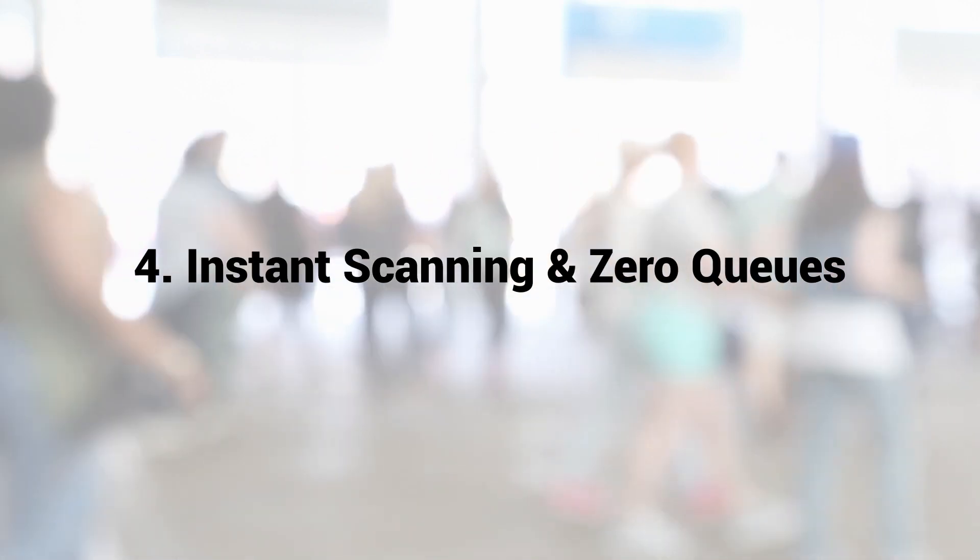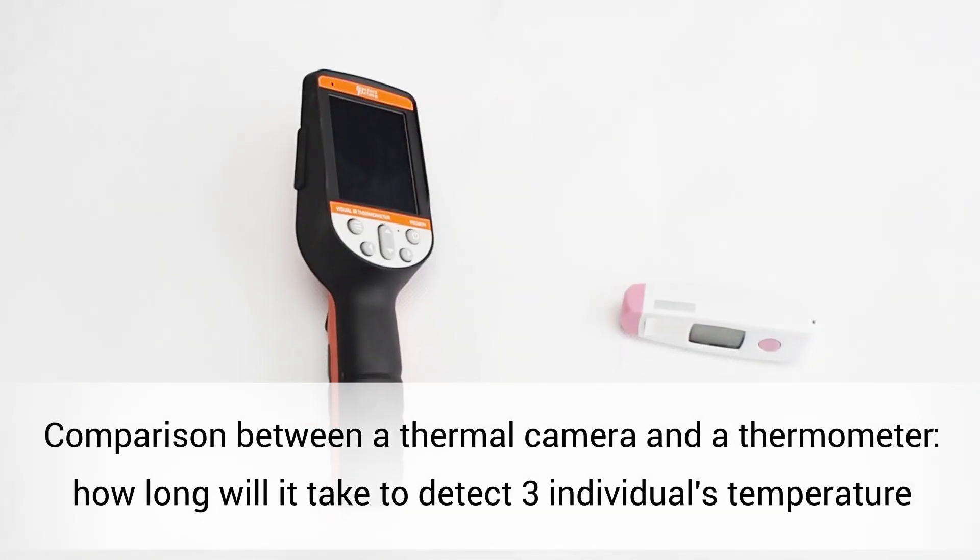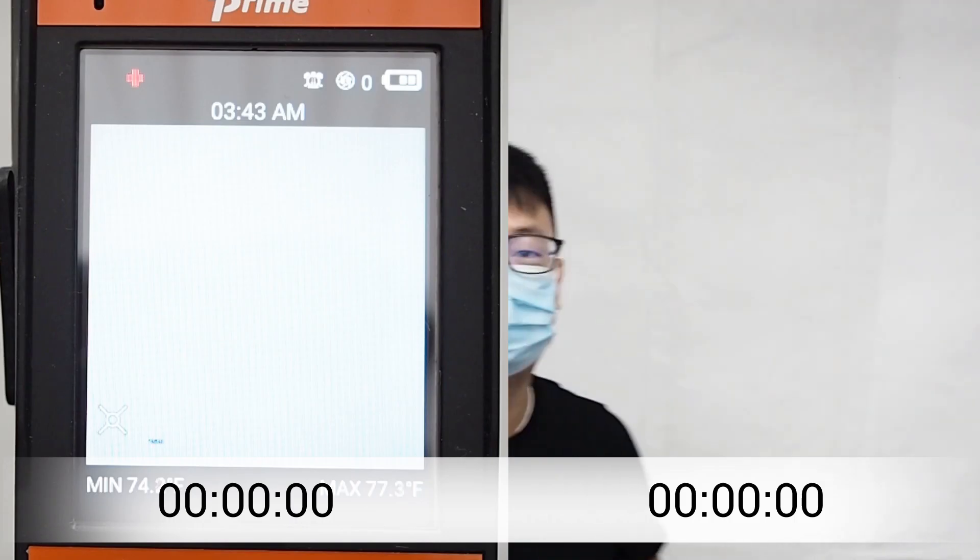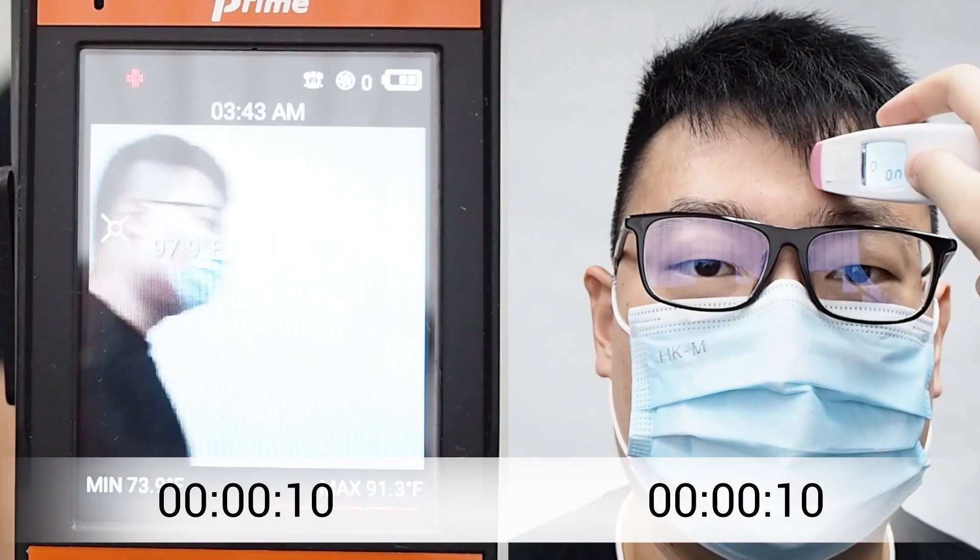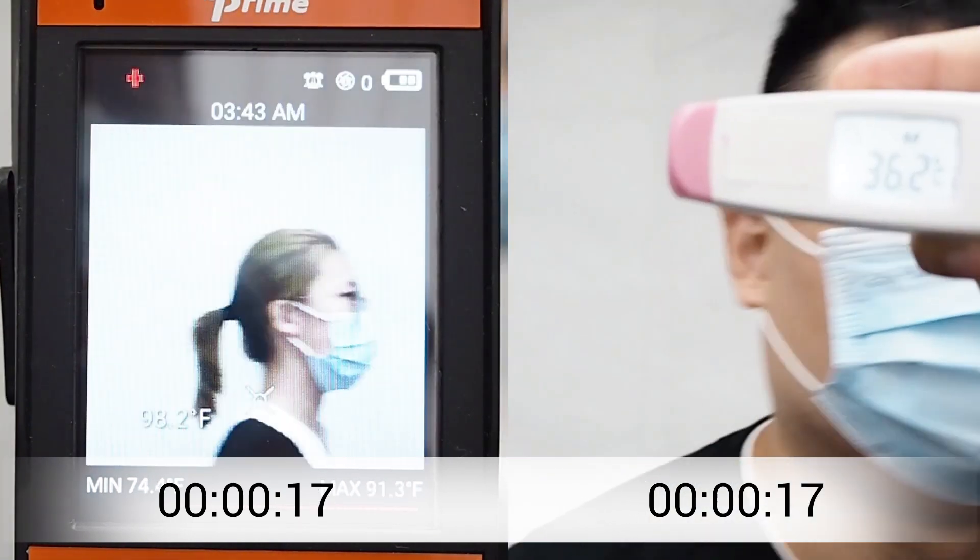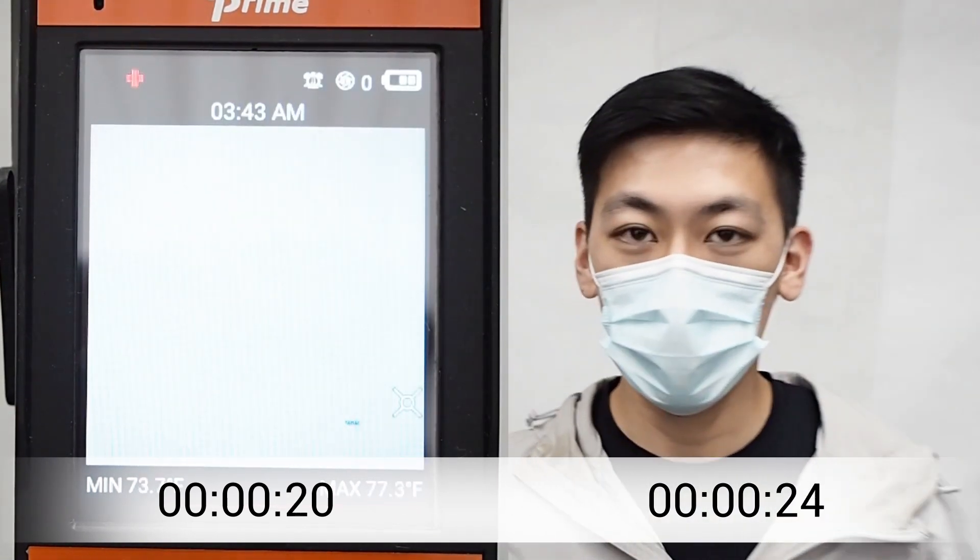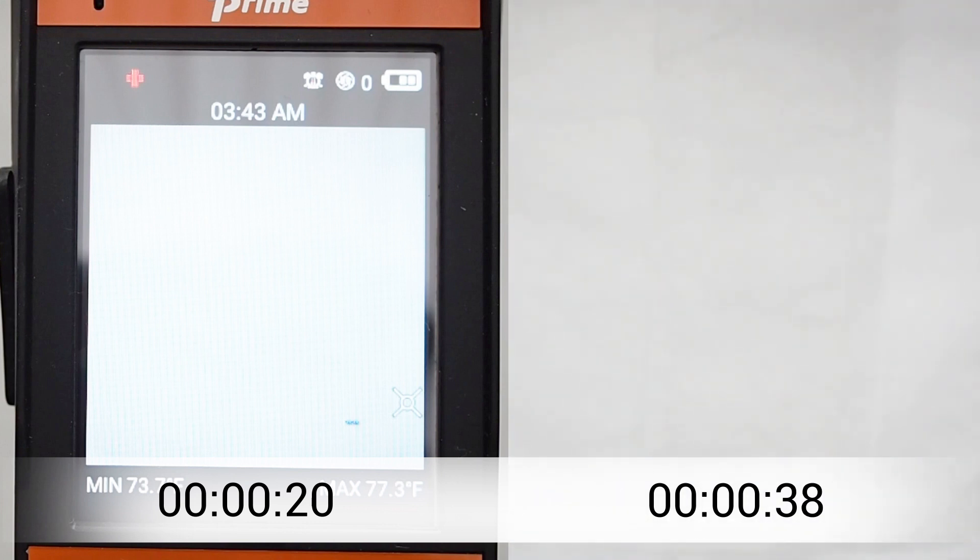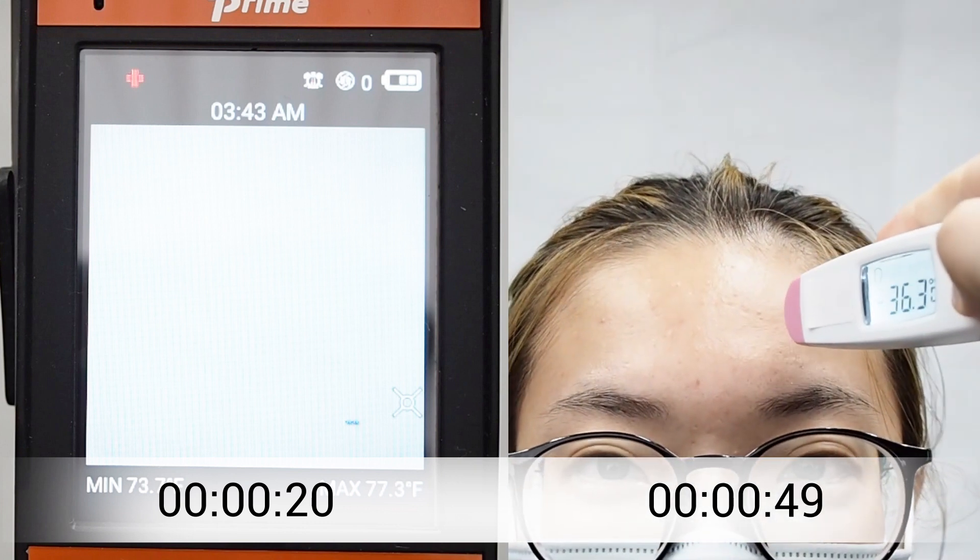Instant scanning and zero queues. With multiple sensors and active heat tracking, the IR0280H has clear advantages over traditional laser thermometer guns, which lack efficiency and will lead to queues forming. In comparison, a thermal camera can process individuals without the need for them to stop, allowing social distance to be maintained.